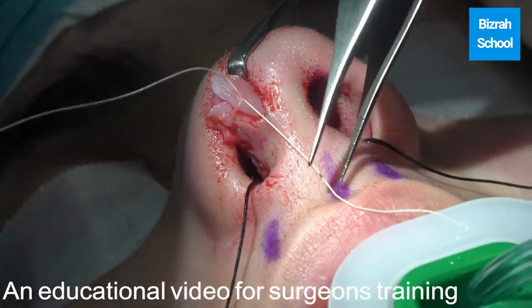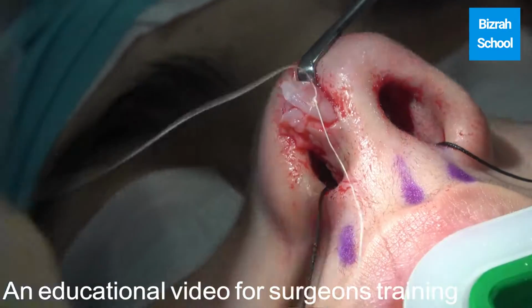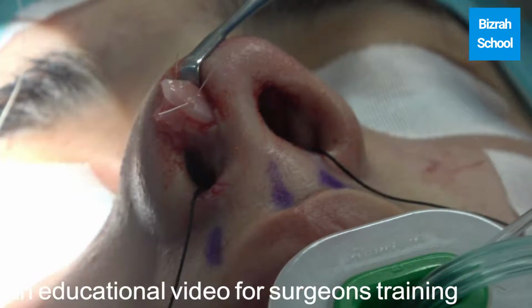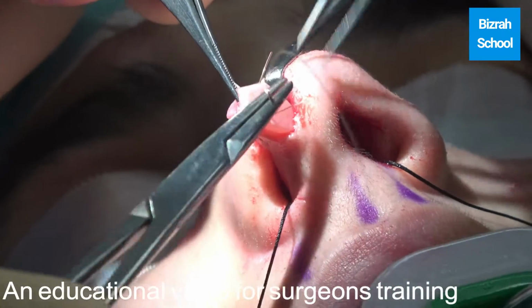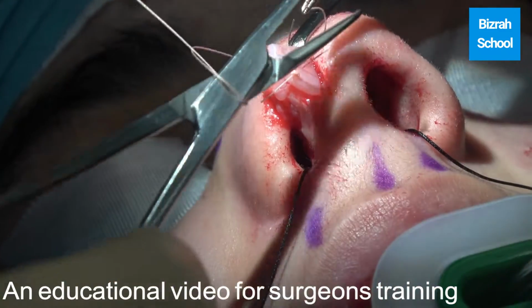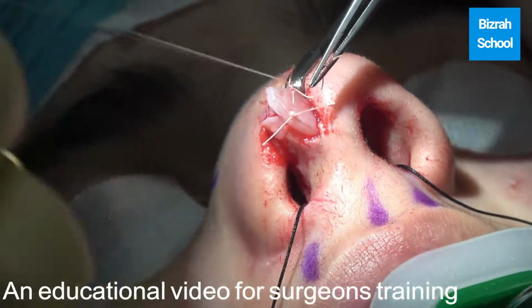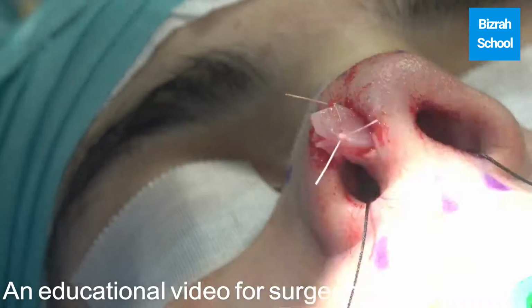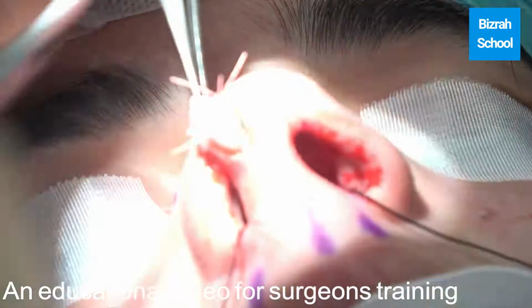So we are creating a very strong structure in the midline to support the tip and to achieve tip elevation, tip projection, tip definition, tip refinement, and more tip rotation. Most patients like to have a very nicely projected tip with more definition and refinement of the tip. You see, under local with sedation, there is not much bleeding.